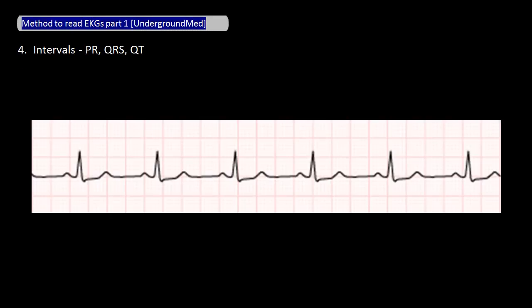After determining the axis, the next thing I look at is the PR interval using the rhythm strip. The PR interval should be less than five small boxes, or one big box. Eyeballing it, you can see that distance is slightly less than one large box, so the PR interval is not prolonged.